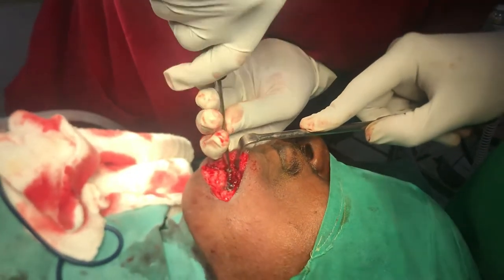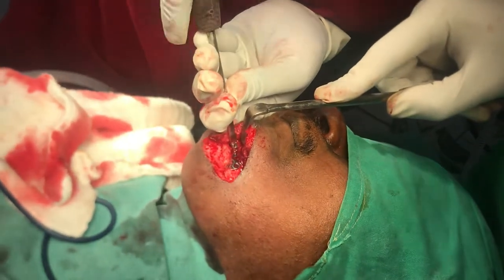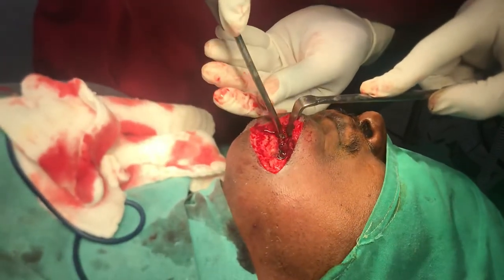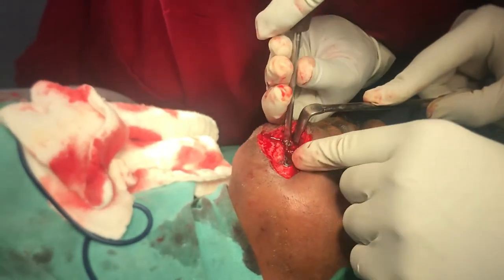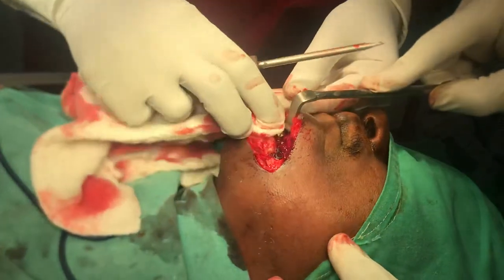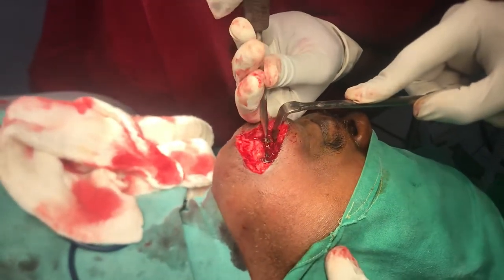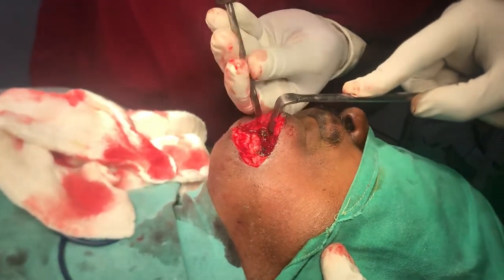The interesting thing is on this radiograph and the scan, the bone is totally united. I think the whole infection started from one screw — clinically it looks like two now. It was a four-hole plate used with four screws. These two screws were really, really hard and well integrated, but the other two screws were the reason — we already removed them.